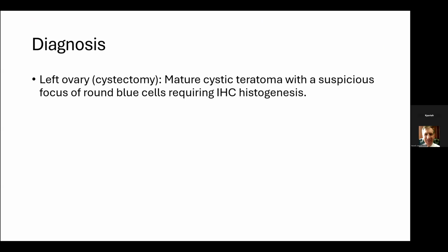It's a mature cystic teratoma, but there's this particular focus that I can't really commit to by saying whether it's an immature part or just something different. And so that was my main reason for presenting this case. Hopefully, I had someone who was traveling outside, because up to now, I haven't started immunohistochemistry yet.